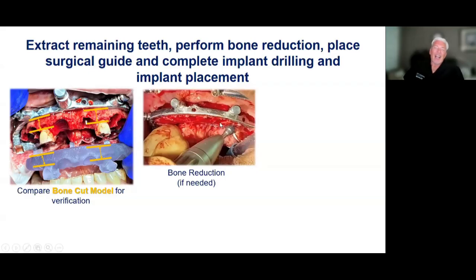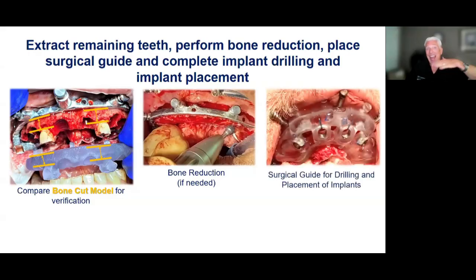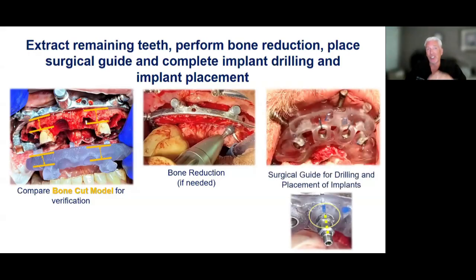Some people may use different burrs, but this is a nice baseball-sized burr. Dr. Picos has a burr, I think, that's a great burr. They call it the Picos burr. It really gets in and gets after it. But here you know exactly where the bone needs to be reduced, to what level, and to what angle, anterior to posterior.